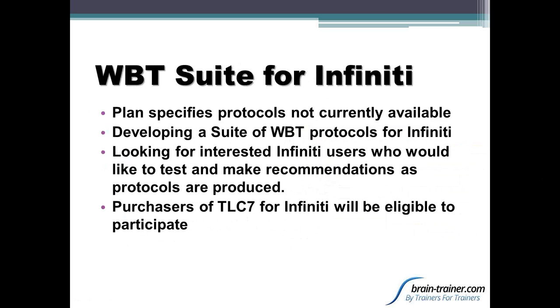The whole brain training suite of the protocols is something that we've started to work on. Francois had several of them in his earlier suite, but there are a number of things that we would like to add to it. So the plan will include some protocols that are not currently in the suite. You would have to take those from other suites that you might be using in Infinity.